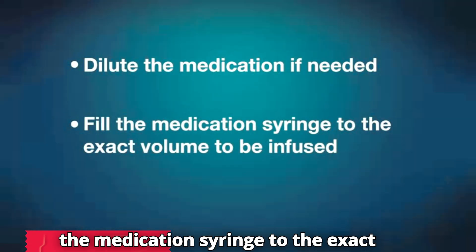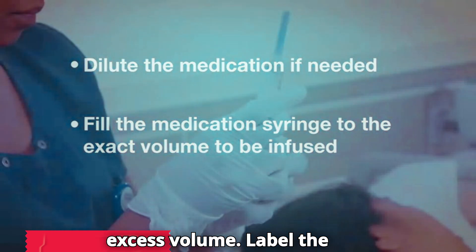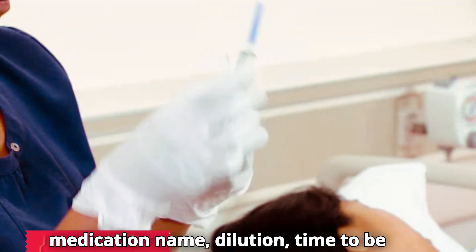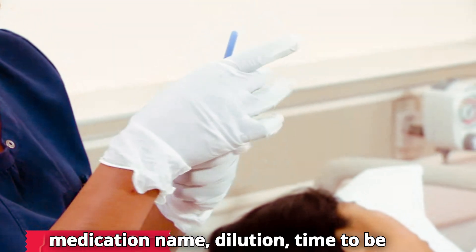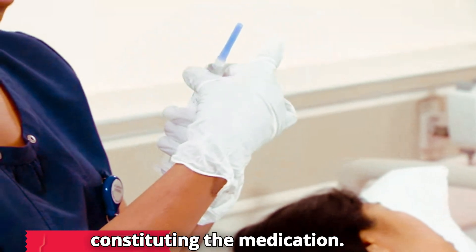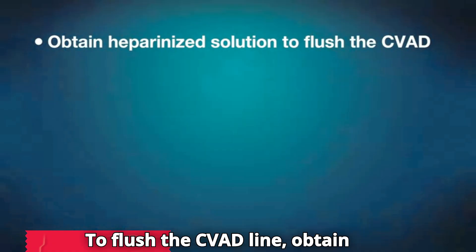Fill the medication syringe to the exact volume to be infused and expel excess volume. Label the syringe with the contents, including medication name, dilution, time to be administered, route, and name of person constituting the medication. To flush the CVAD line, obtain heparinized or saline solution.